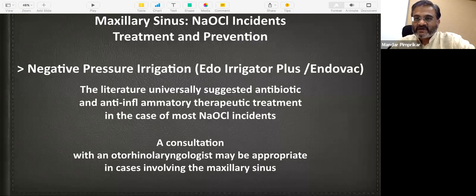With this, you will be able to convert the irrigation flow from laminar to turbulent, because then there is no danger of pushing your irrigant into the periradicular tissues. As you move ahead and reach apical 1/3, change that needle from wide bore to 30 gauge needle. That will reduce a lot of stress on your hand. And also you will be safe. Also you will be able to clean the root canal system in a better way, because coronal 1/3, pulp chamber, and the middle 1/3, you will be at ease while doing irrigation. Try and do it and let me know the feedback about it.